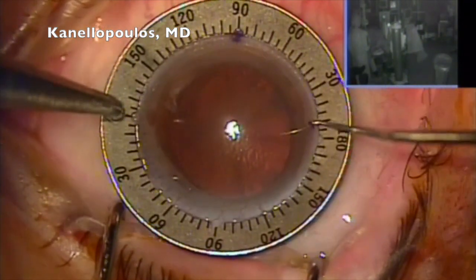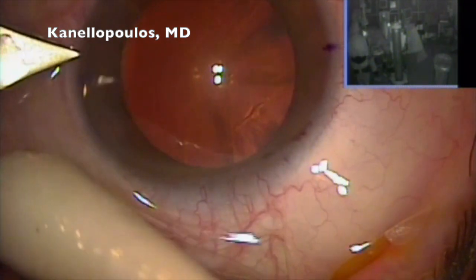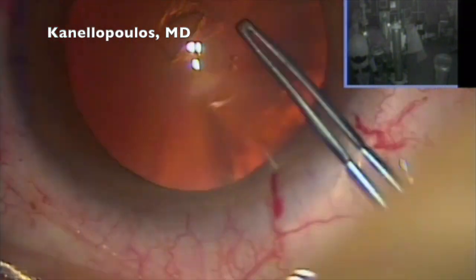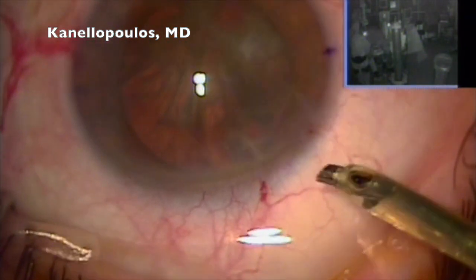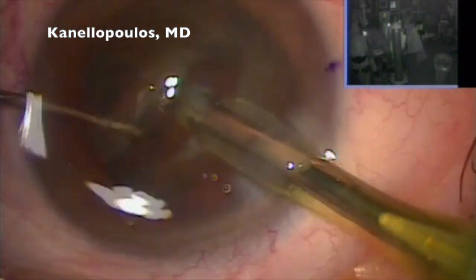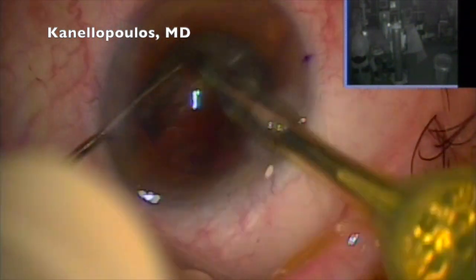T4 at 008. A little trigonometry here, marking the 8 o'clock position, the 135 for my incision, rinsing the residual betadine and some mucus — the three-step incision. We've used the femto in the past to both do the capsularexis and do the corneal incisions, but we have come back to manual as it seems to give much better corneal incisions. In Europe in general, the femto has been abandoned from corneal incisions altogether. Some people still use it for capsularexis, but we know the manual capsularexis is more resilient to the intraoperative manipulations.